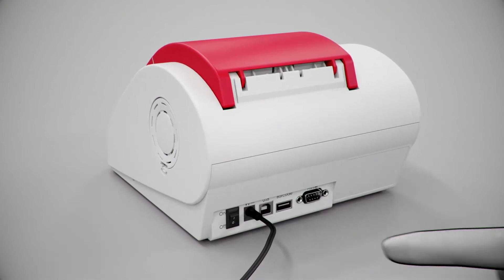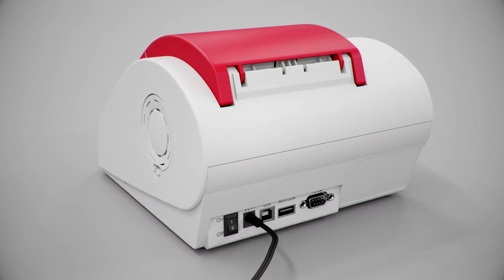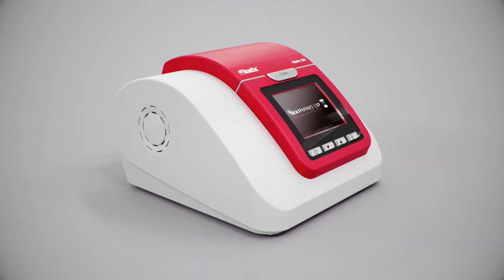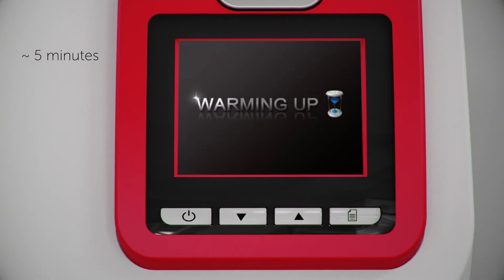Start the analyzer by turning the power switch on. Close the lid if opened. Warming up will start. The display will show warming up until the device is ready for use, showing standby mode.